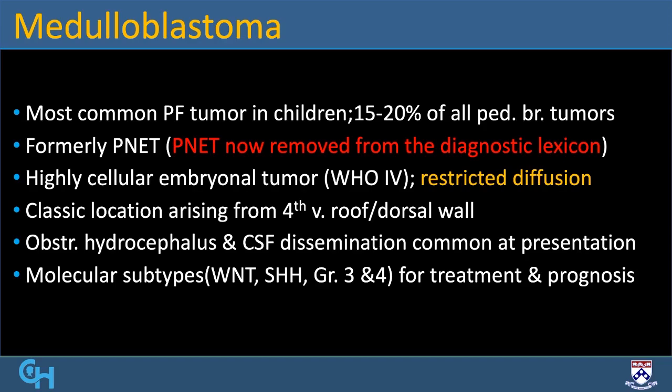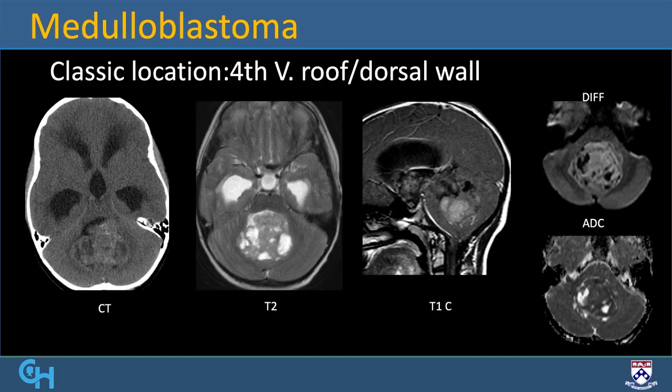We don't have time to go over the details, but these are important for management as well as in predicting the prognosis of the tumor. So let's look at a classic example.